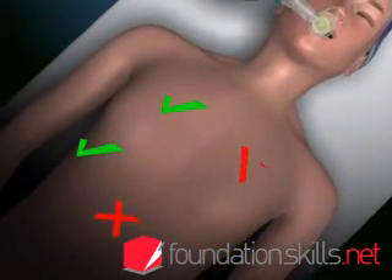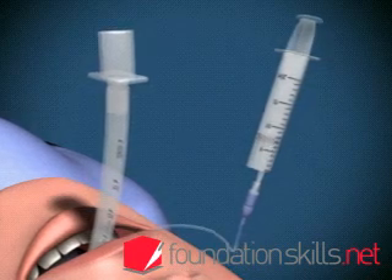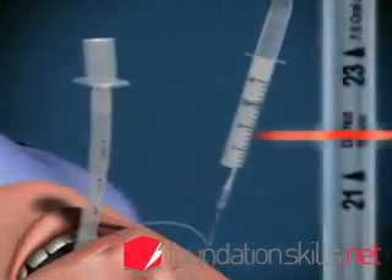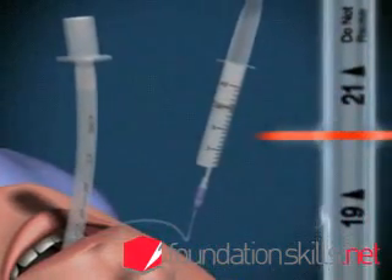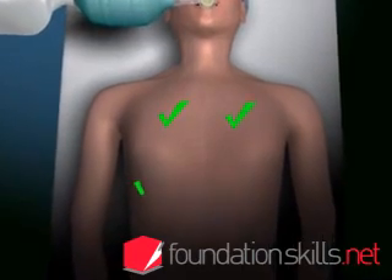If the tube is in too far, the right lung will be ventilated only via the right main bronchus. If this occurs, deflate the cuff and withdraw the tube 2 to 3 centimeters, then reinflate the cuff and recheck the position.